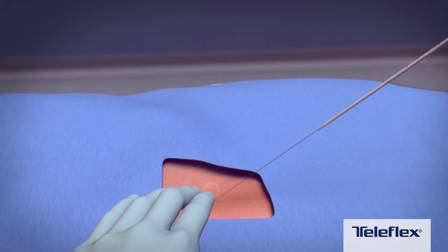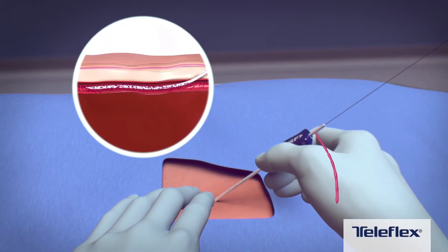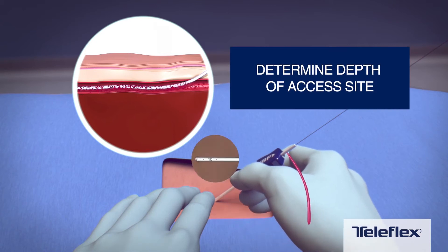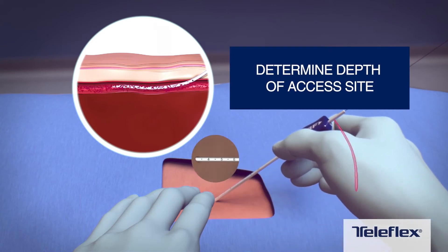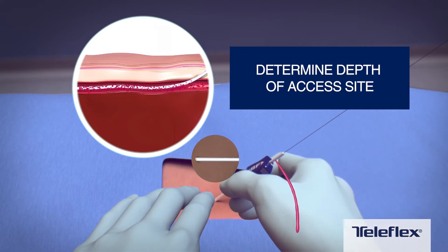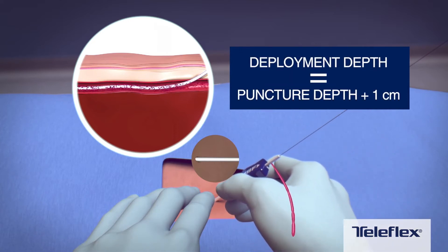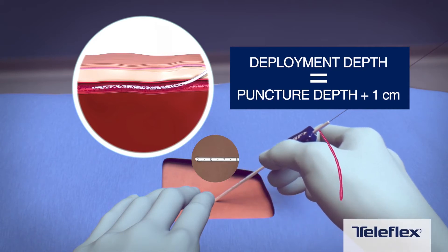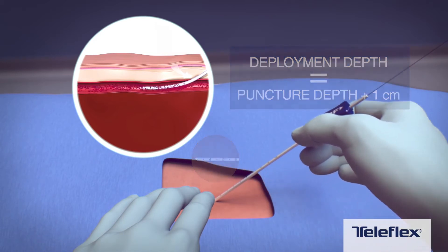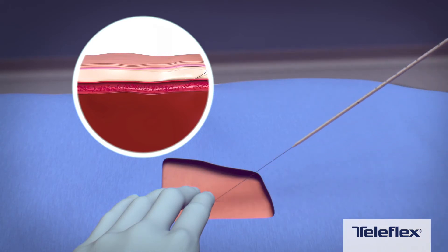Before the large-bore procedure, determine the depth of the access site using the depth locator. This is inserted over the 0.035 inch guide wire until blood flow is detected at the outlet. Retract the depth locator until flow stops and note the position number at skin level indicating the access site depth. Add one centimeter to this depth to determine deployment depth for later device positioning.